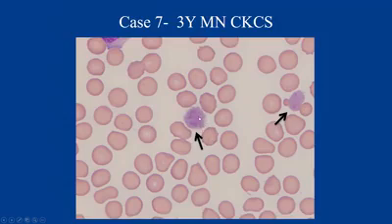So these are actually platelets. These are large platelets, or what are termed macroplatelets. They are quite big, all right? So in order to be termed macroplatelets, they need to be about the size of or larger than red blood cells, okay?